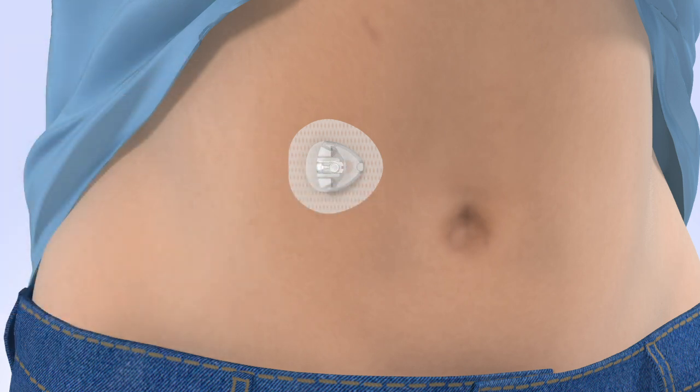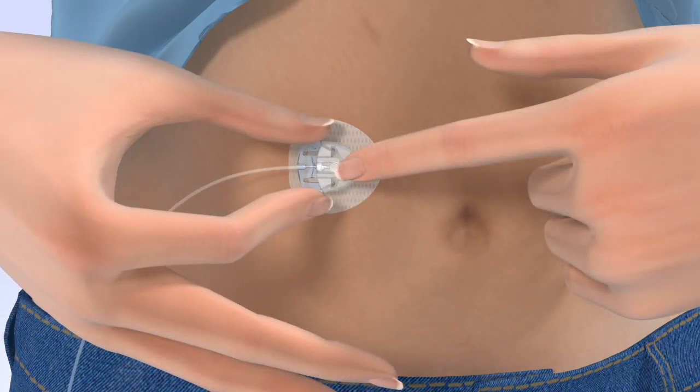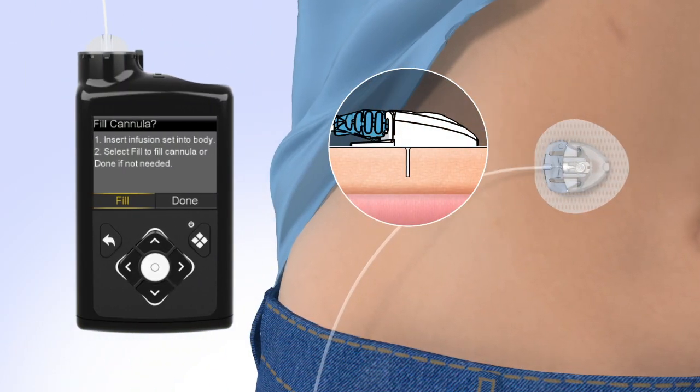Smooth the adhesive onto the skin. Hold the cannula housing steady with your finger. Then push the site connector straight into the cannula housing until you hear a click. Now that the introducer needle is removed, the cannula is empty and will need to be filled with insulin. On your pump, select Fill.